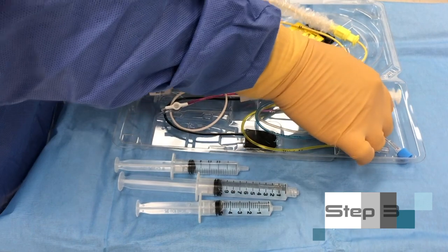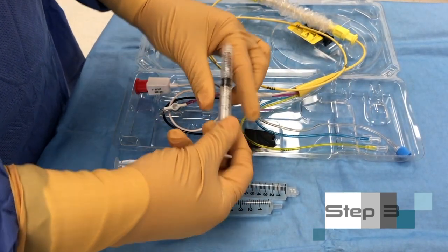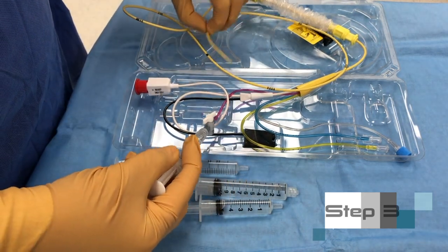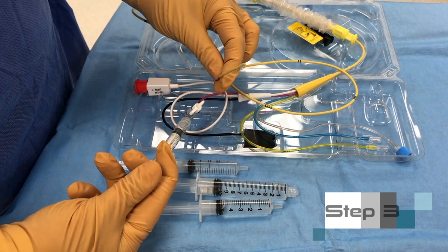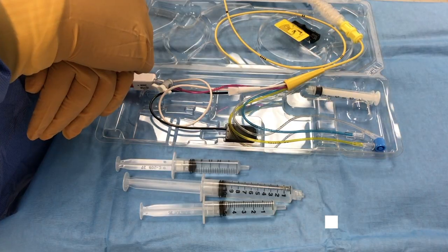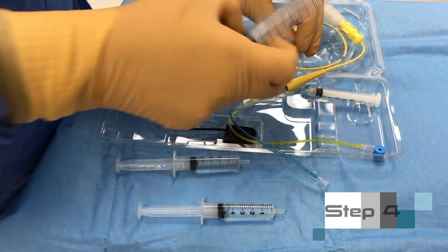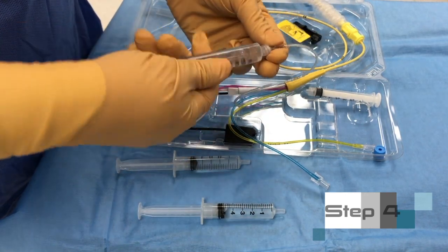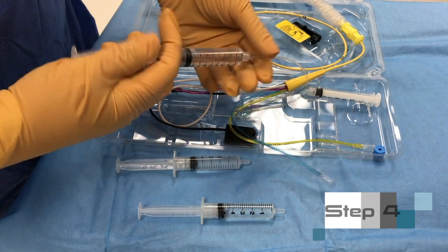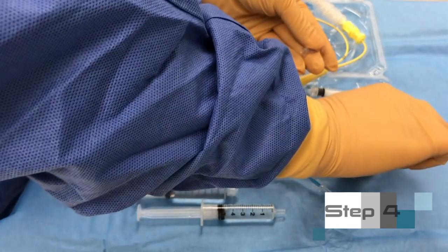Use the provided syringe to check patency of balloon by filling with 1.5 mL of air. Then deflate the balloon. Step 4. Flush the infusion lines with sterile saline. Cap the infusion port.